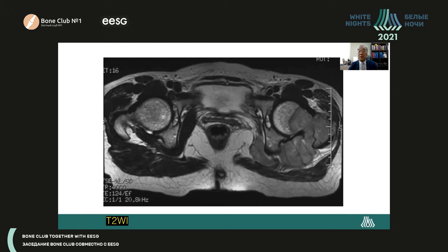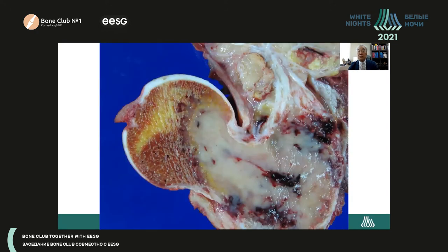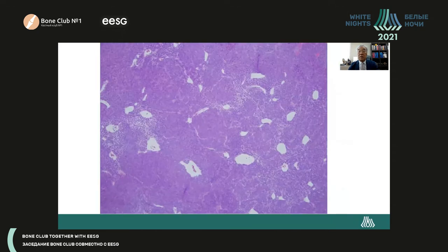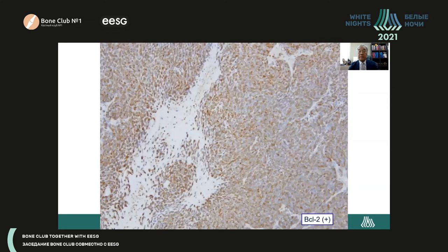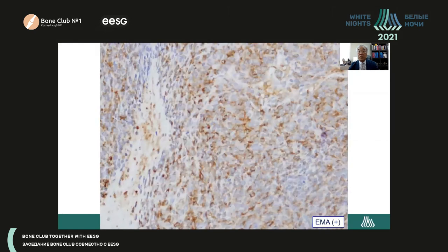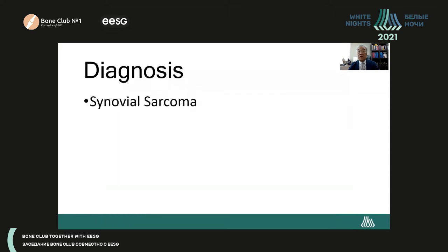The lesion extends into the posterior aspect of the hip with involvement of the left internal obturator muscle. After biopsy diagnosis, the lesion was resected. The cut surface shows mixed gray-white tumor tissue on the femoral head and neck areas with hemorrhage. Histologically, low-power view shows prominent vasculatures and compact cellular nests. High-power view shows hemangiopericytoma-like vasculatures with spindle tumor cells surrounding them. LMA is positive and EMA is also positive, which is important to differentiate from malignant peripheral nerve sheath tumor. The final diagnosis is synovial sarcoma.